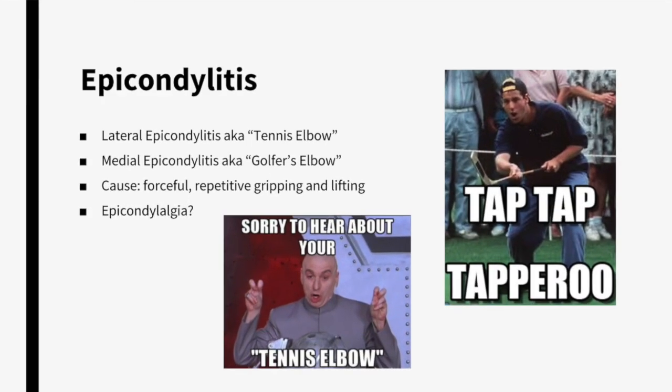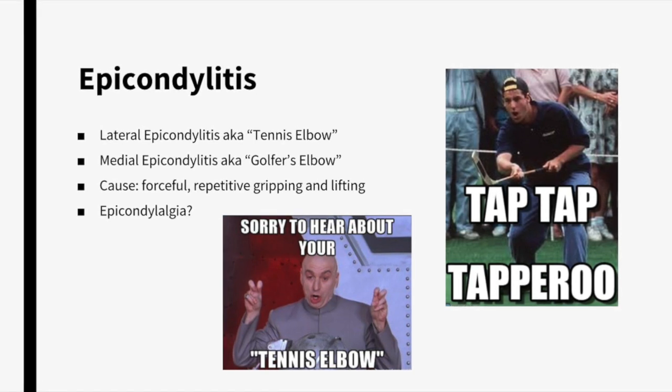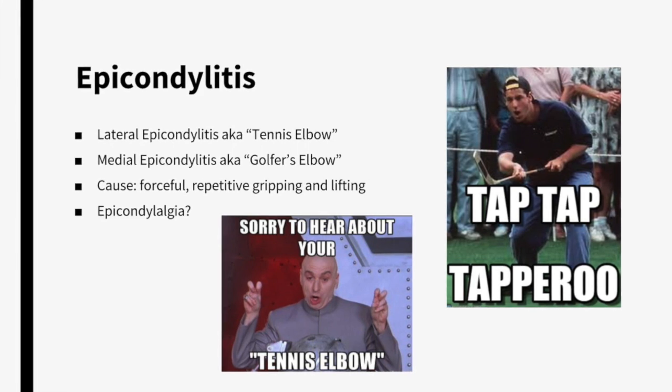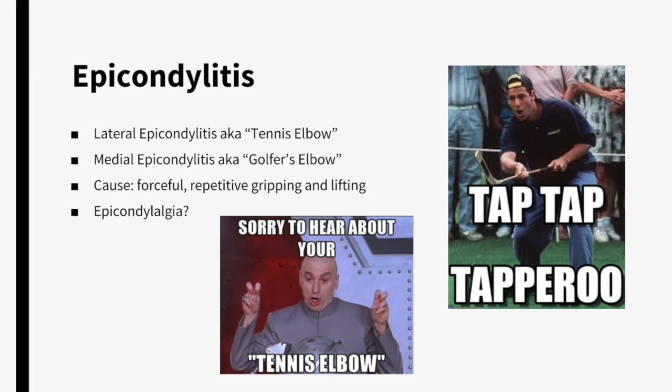So next we will talk about iontophoresis to treat patients with medial or lateral epicondylitis. Lateral epicondylitis, or most commonly known as tennis elbow, is defined as the inflammation of the lateral humeral epicondyle at the origin of the extensor tendons of the forearm.